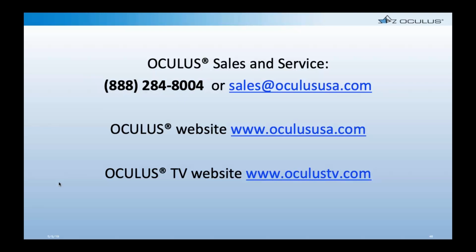So the next question says, before a patient reaches full treatment, what do you give while vision is not quite fully corrected? Do you use daily soft contact lenses? Yes. I guess that's not really part of our topic tonight, but absolutely. If I have a patient who's a fairly high prescription, again, it depends. If I have a 10-year-old child who came into the office wearing year-old glasses, seeing 20/50, I'm not too worried about them seeing 20/50 the day after their first night in Ortho-K, and 20/30 2 or 3 days later. It's still better than they were.